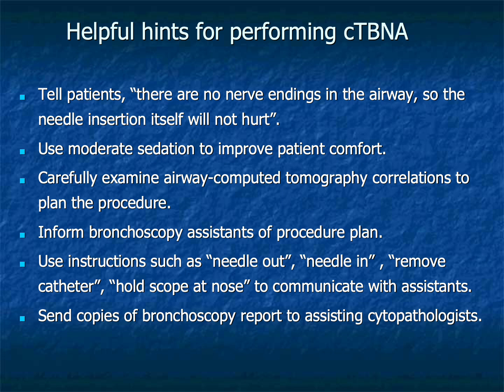Good communication with the bronchoscopy team is equally important. Simple commands such as "needle out," "needle in," "hold the scope," or "remove the catheter" allow assistants to anticipate each step and reduce unnecessary movement during the procedure. Finally, maintaining close collaboration with cytopathologists improves both specimen quality and overall diagnostic success.